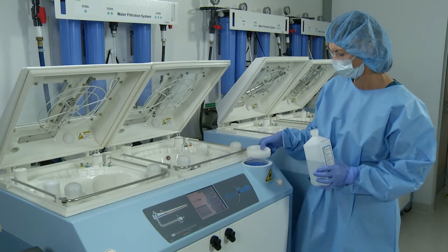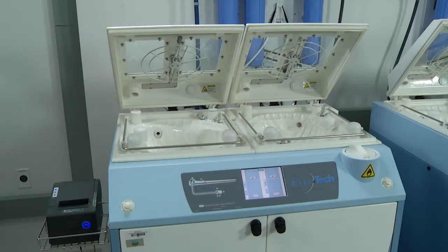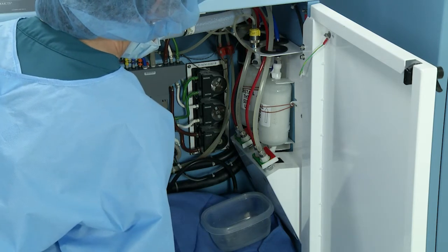Close the alcohol fill port lid, and the system will automatically detect the additional solution. To change an internal 0.2 micron filter, first unplug the EVOTECH. Wearing PPE, place towels or absorbent cloths to absorb any dripping water.